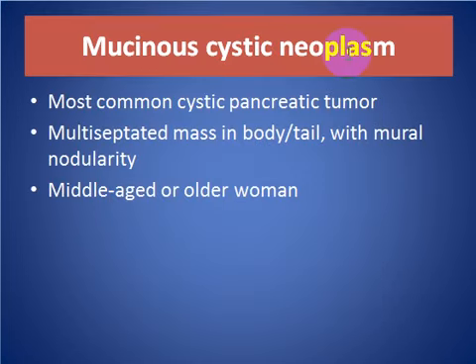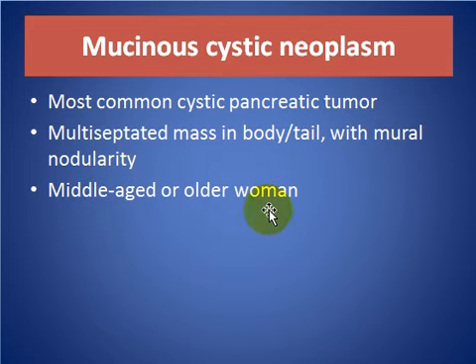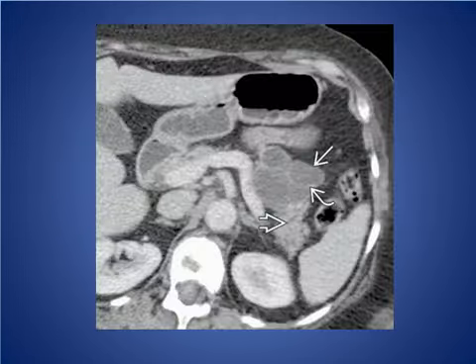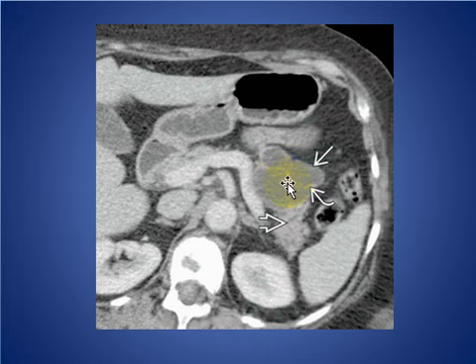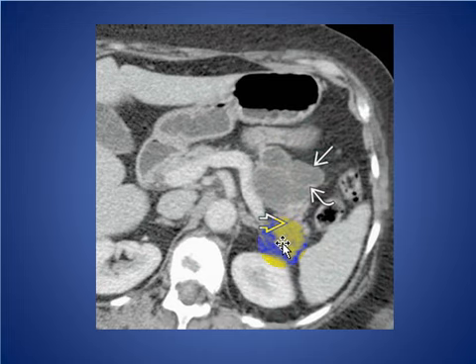Mucinous cystic neoplasm: the most common cystic pancreatic tumor — a multiloculated mass in the body or tail with mural nodularity, typically in middle-aged or older women. Here we see a cystic mass lesion with a large cyst in the tail of the pancreas, with septation, enhancing septation, and minimal dilatation of the upstream pancreatic duct with no pancreatic atrophy noted.